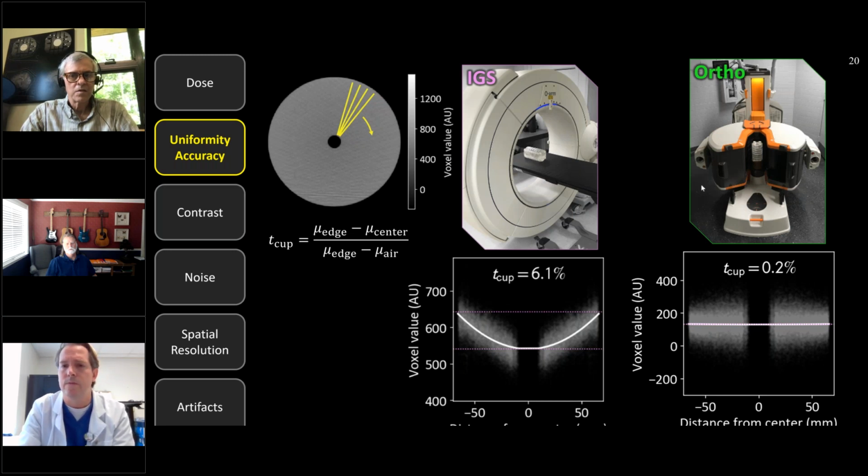And so here are two systems, a scan of the Corgi. This system hasn't put very much effort into its scatter corrections and shading artifact corrections. And so you have a relatively strong cupping artifact, and maybe perfectly suitable to what this system is designed for. But as opposed to this one, which is a diagnostic scanner for orthopedics imaging. And here you see a high level of uniformity and a low cupping artifact effect.